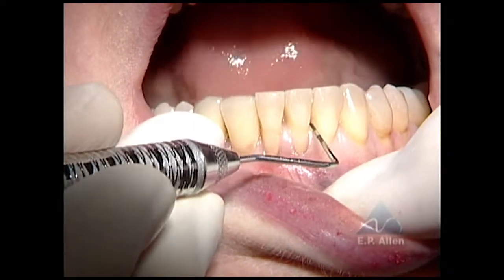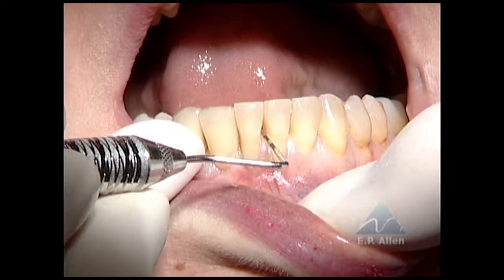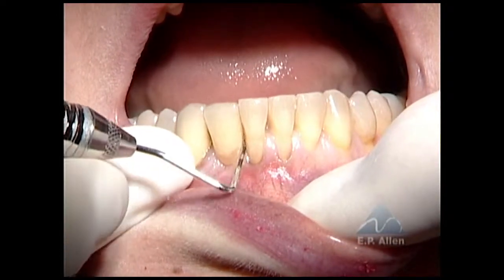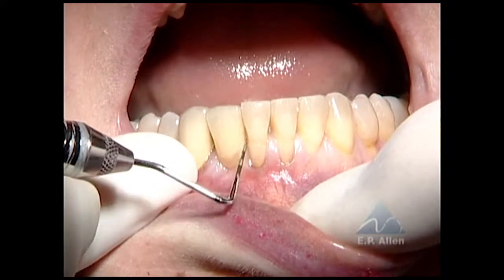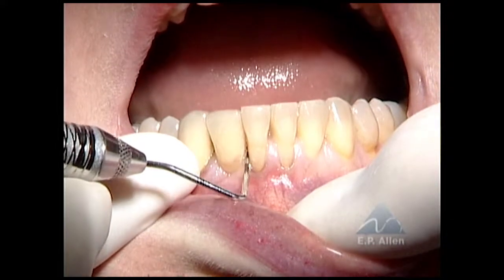Same thing here — this is a way of checking it. Just passing the probe through gives you an idea of the width of the papilla at the crest. It's a little close here next to the pontic, but of course there's no root in the tissue there.